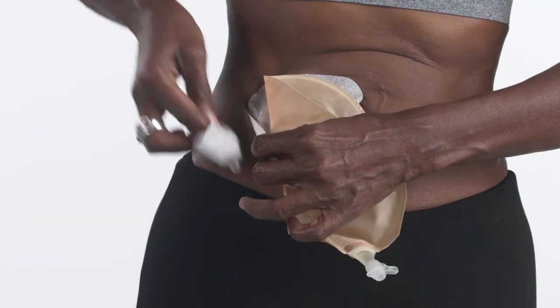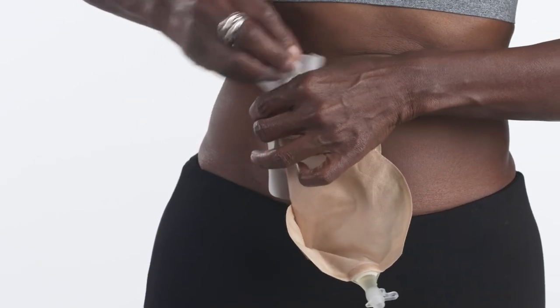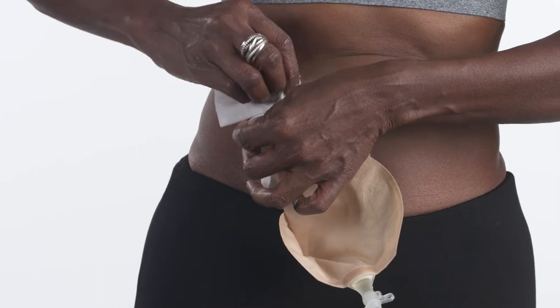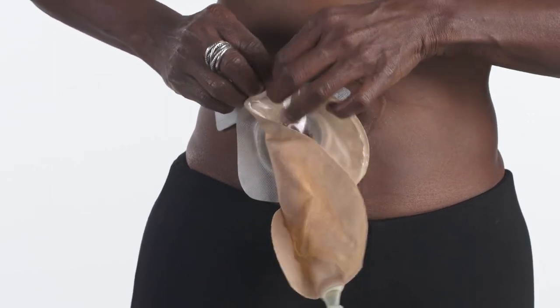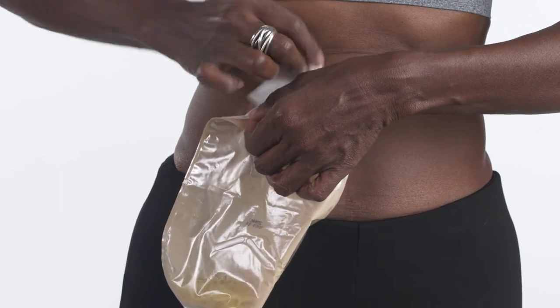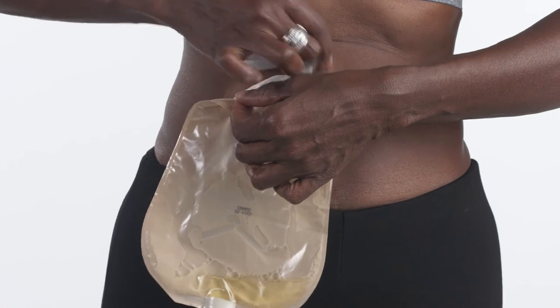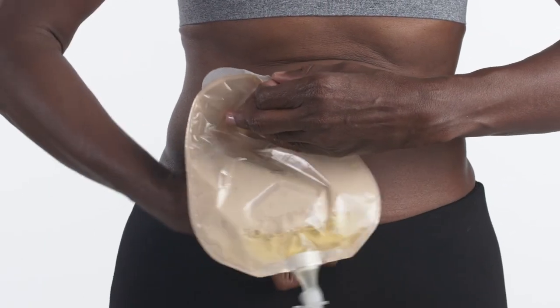To remove the system, clean the surrounding skin with an adhesive remover wipe or spray. In this demonstration, we are using a wipe. Lift a corner of the skin barrier or tape, wipe the adhesive remover between the skin, and then gently peel the adhesive down and away while continuing to wipe. With the other hand, push down on the skin above the barrier to aid removal.